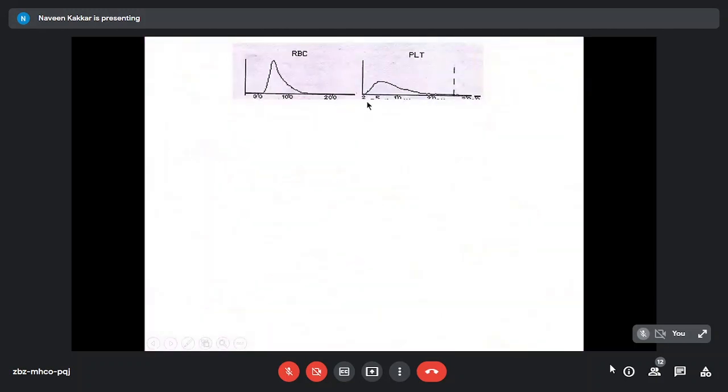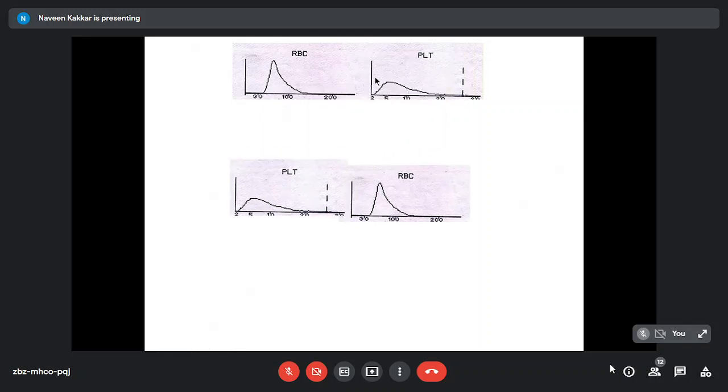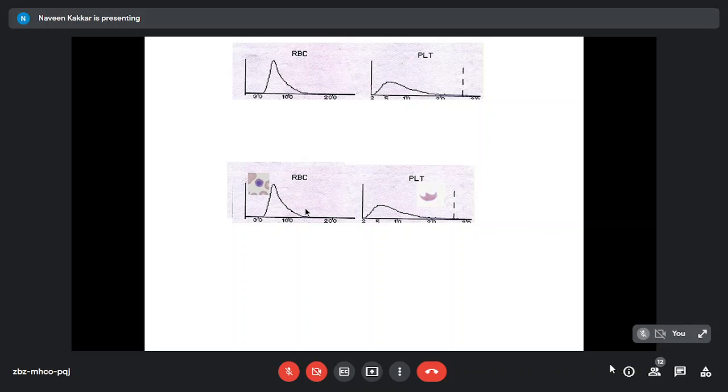Remember, in the last talk we looked at this histogram. The platelets and the RBCs are actually counted together, and that's how it's generated within the instrument. Volumes less than 20-25 are counted as platelets and higher ones as red cells. So in this patient, what happened? Your red cells fragmented because of burns, and they cause volumes lower than 30, which fell into the platelet zone. So the platelets were counted more than normal. So here your red cell fragments were being counted as platelets.